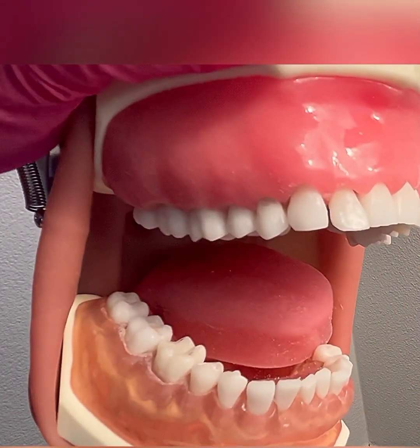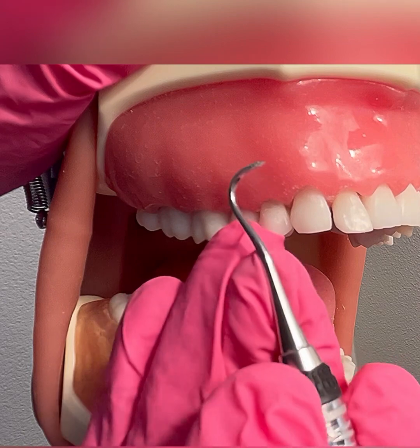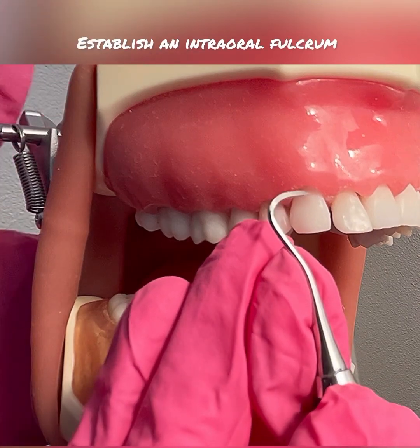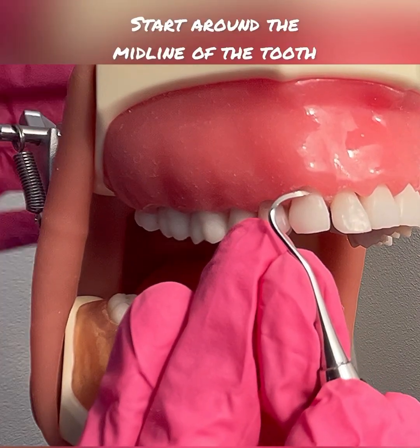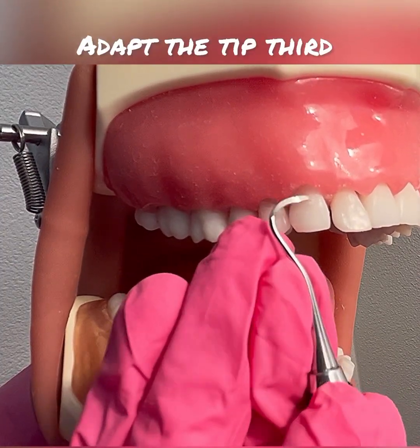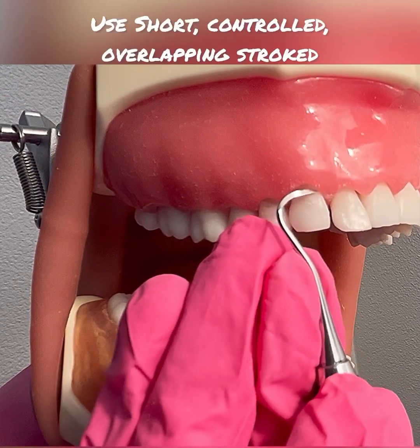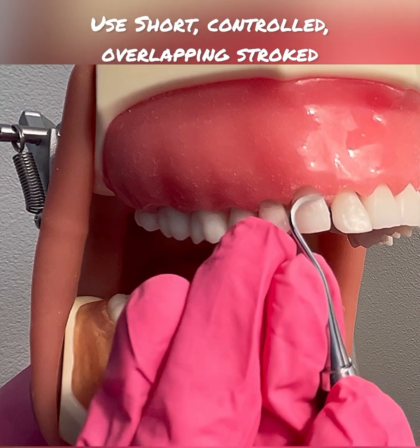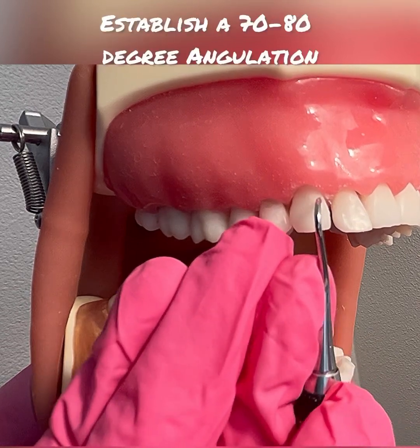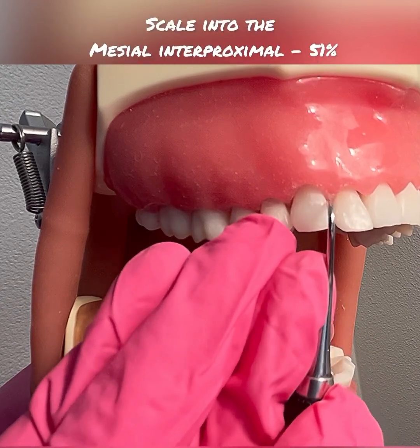For right-handed clinicians, you would start at tooth number 6. Left-handed clinicians, you will start on tooth number 11. I have a good modified pen grasp, good ergonomics, and an intraoral fulcrum. I'm going to bisect the tooth right around that midline, adapting the tip third. I'm using a wrist activation with short, controlled, overlapping vertical strokes across the direct facial. I'm going to roll my instrument between my index and thumb, staying adapted with the 70 to 80 degree angulation as I roll into the mesial interproximal.